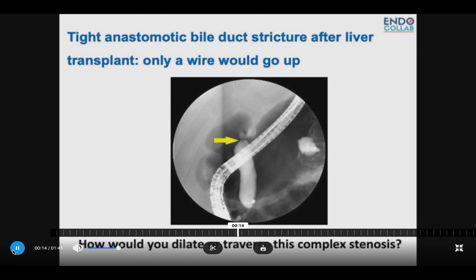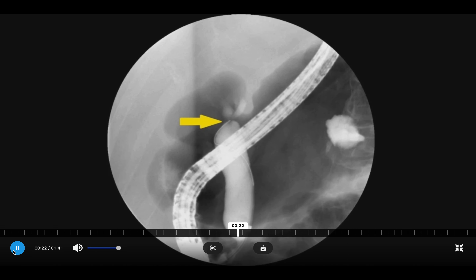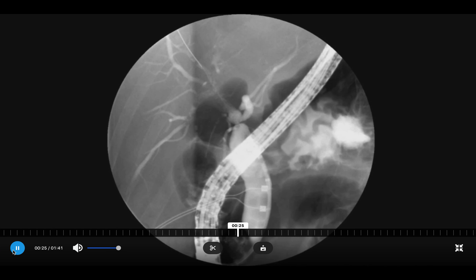Today we present a patient with a very tight anastomotic bile duct stricture after liver transplant that could not be traversed with any device. Only the wire could go through.